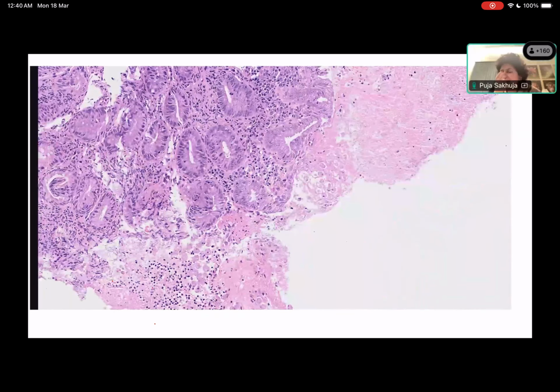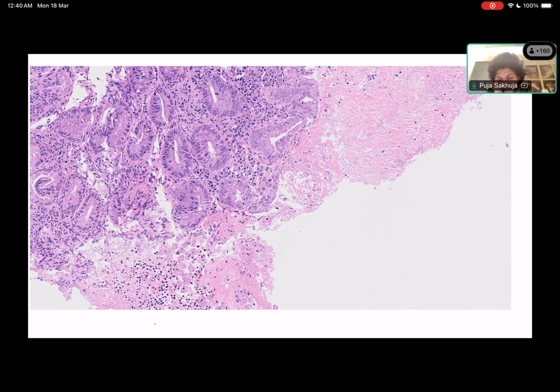So did I say what the biopsy site was? No, I think I didn't, right? No. Okay, so now who has described the slide? Jinsi has described this. Pragya has described. Ansha has described. Shriyoshi, have you described? No, ma'am. Okay, Shriyoshi, then you can describe this.